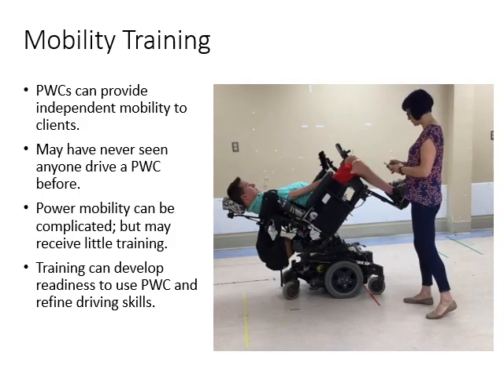When it comes to power wheelchairs, it gets a little bit more complicated because many power wheelchair candidates may have impaired motor, vision, and cognitive skills. They may never have seen somebody driving a power wheelchair. And power mobility can be quite complicated, but people may have received very little training.